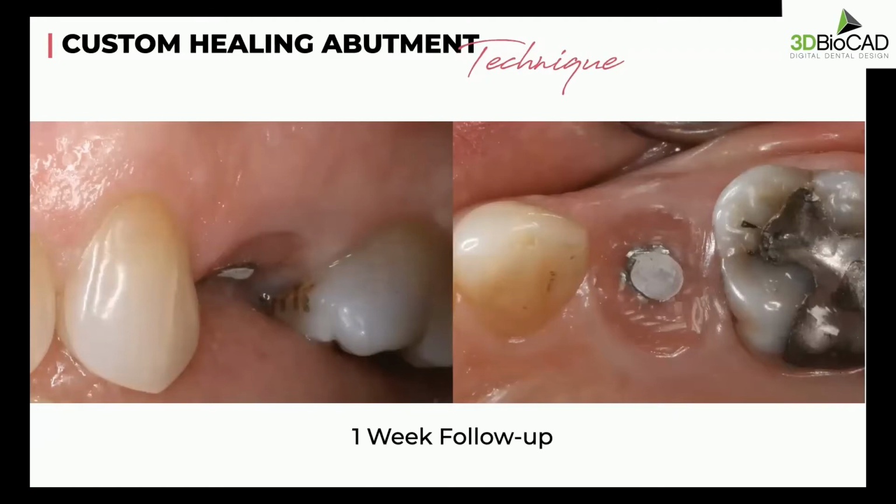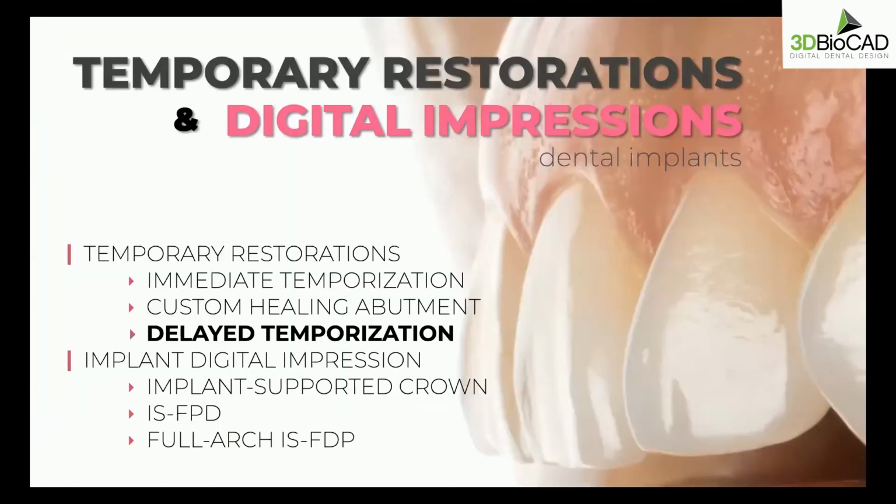So whenever I can do immediate implant placement and do temporary crowns or custom healing abutment, I'll be doing that because the result is very, very good. So soft tissue contour is well maintained. The bone graft particle is well contained. So we get minimal shrinkage happening on the buccal aspect if we do use these techniques.